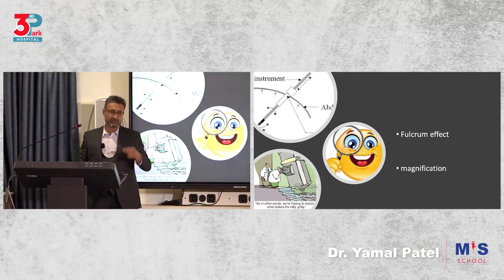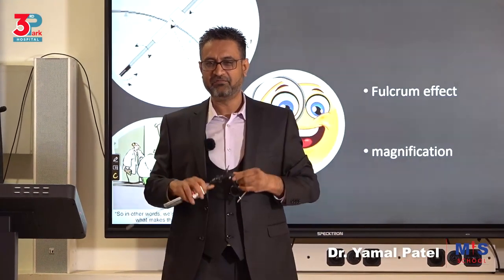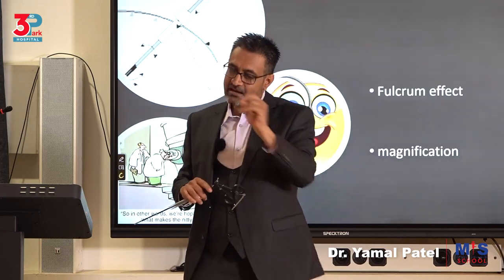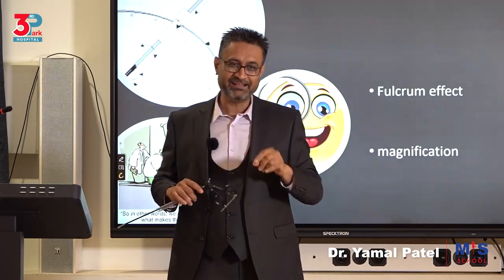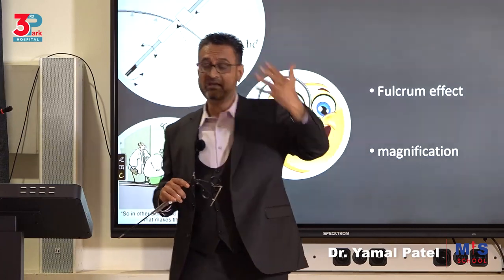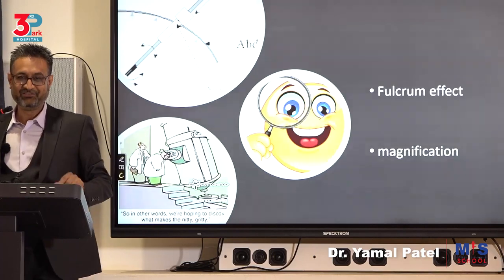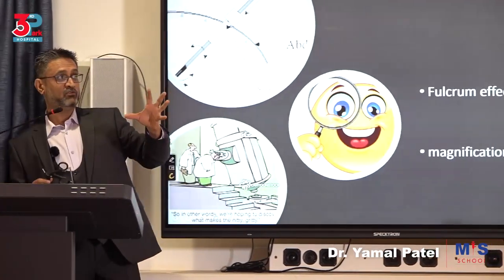Then magnification. You'll see even small capillaries sometimes when you're dissecting in very extreme cases like in endometriosis, where you're going very fine, you'll see up to capillaries. When you cut that, you'll have a little bleed, but that's going to be a very small streak, but on a screen, it might look a bit obvious. So you have to learn that, listen, not every single RBC that you see should be worried about. Initially it will look like, oh, there's a bleeder. So ideally speaking, you remember it's about that.